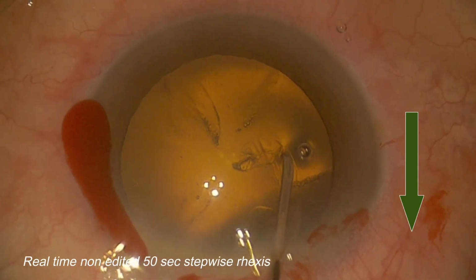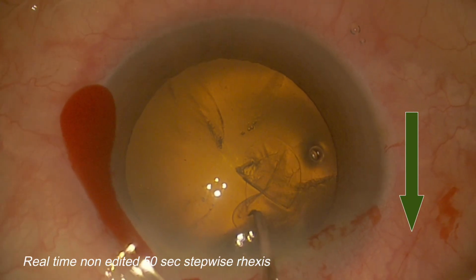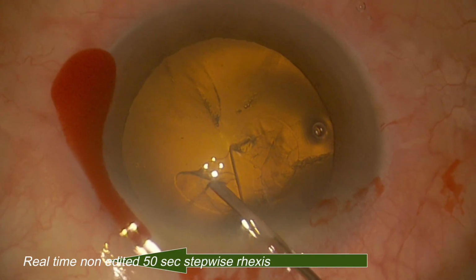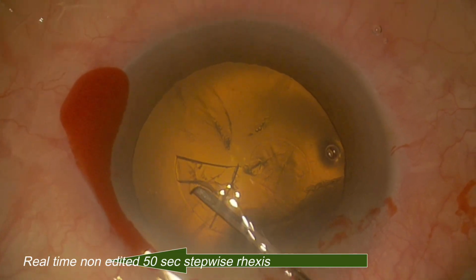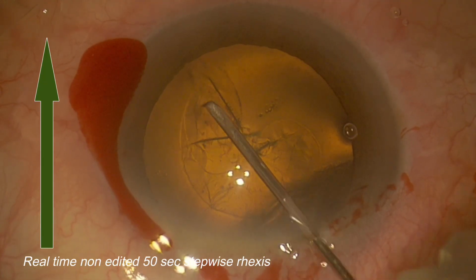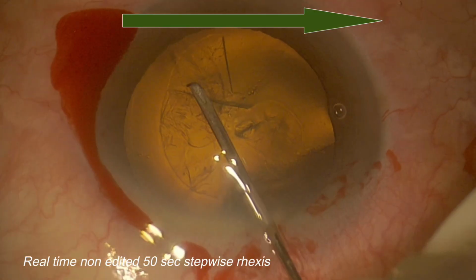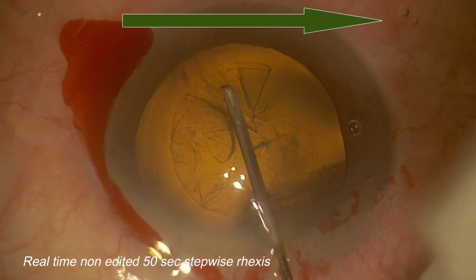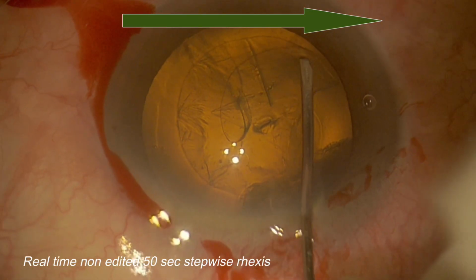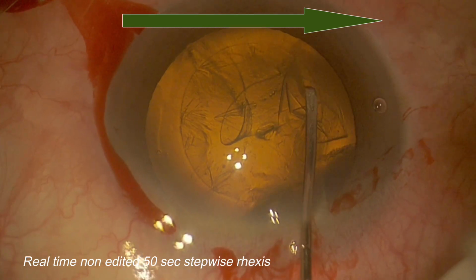As you can see, after the initiation of the flap, you follow the movement like you are drawing a square. So you start moving downward and then direct straight movement to the next side. And after reaching each angle, you switch to a direct straight movement to the next side. And this is to be repeated after each corner. And with every step, you have to do a tiny, small movement, respecting the straight line you are following with each side. So again, after reaching the angle, you follow a direct straight movement, catching up with the last side to finish the capsulorhexis.